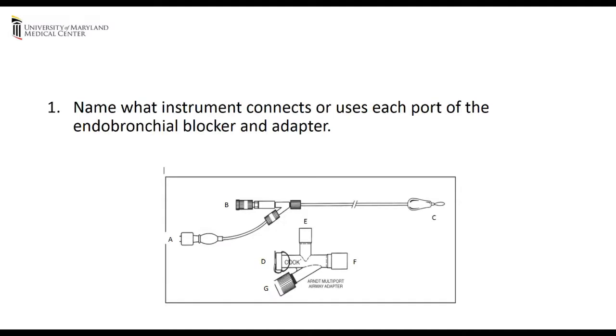In summary, we hope that this video provided valuable information in placement of an endobronchial blocker. There will now be a self-assessment. Please pause the video after each question to test your knowledge on the subject before resuming the video for the answer. Name what instrument connects or uses each port of the endobronchial blocker and adapter.